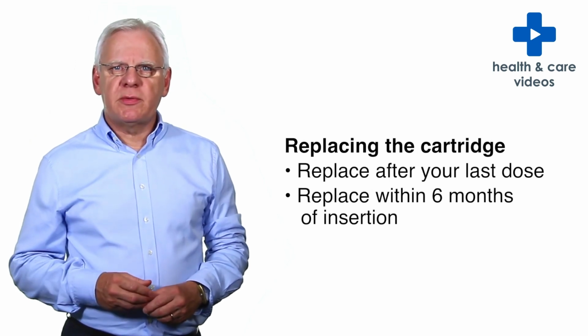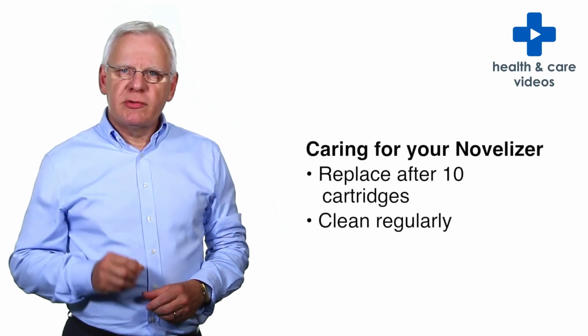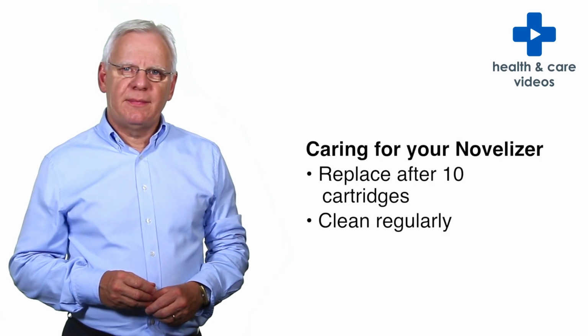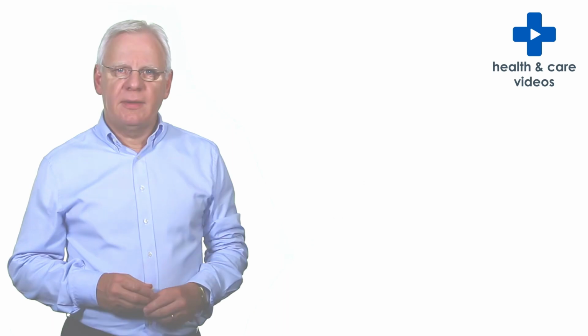Cartridges should be replaced within 6 months of insertion. You should replace your Novolizer after you've used it with 10 cartridges. Clean your Novolizer regularly, or at least whenever you change the cartridge.